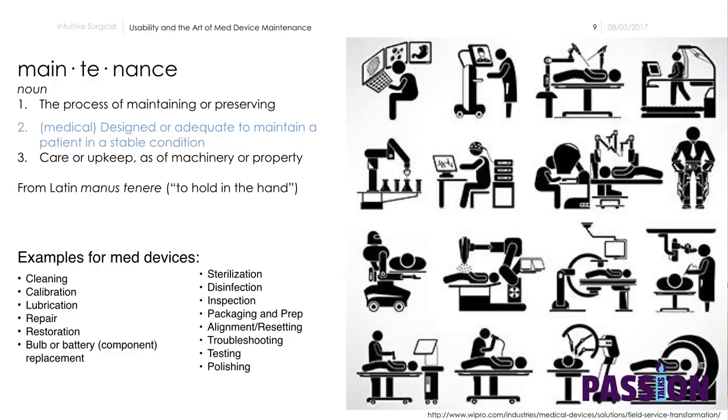So maintenance has some very basic definitions, including keeping, maintaining, or preserving, medically, to keep a patient in a stable condition. The Latin is from "to hold in the hand." There are many activities involved with maintenance: cleaning it, restoring it, changing batteries. There are several steps, possibilities of things that might need to happen in order to guarantee the safe and effective continuation of use of the product.